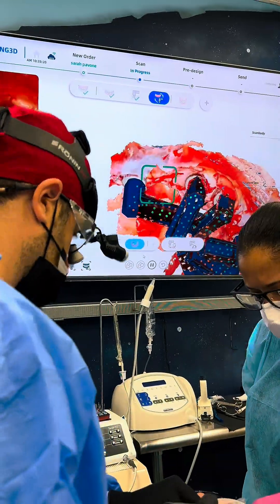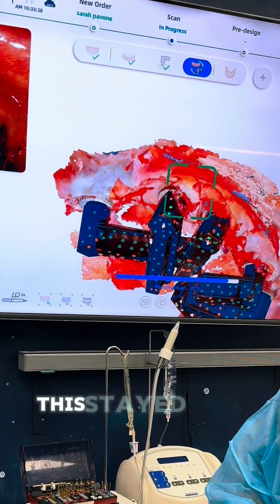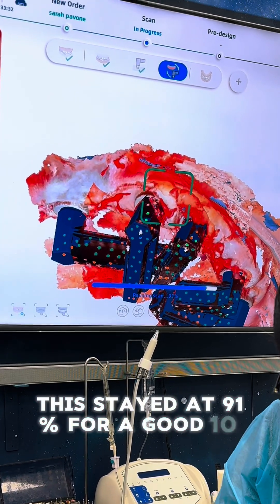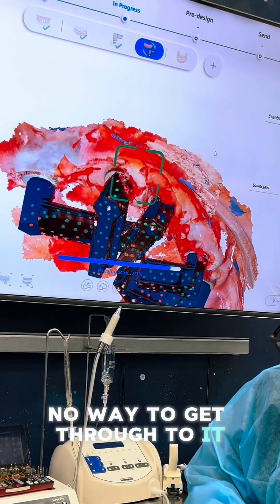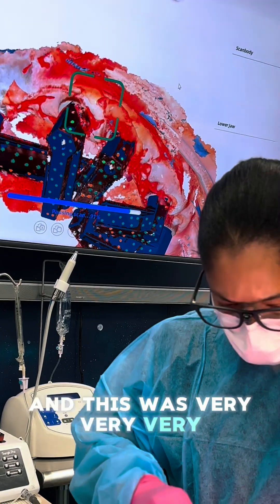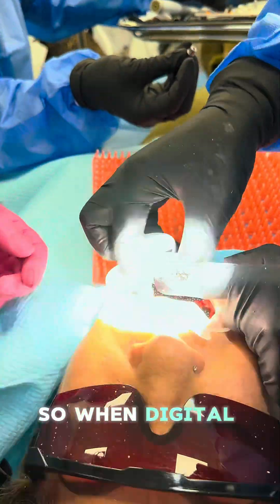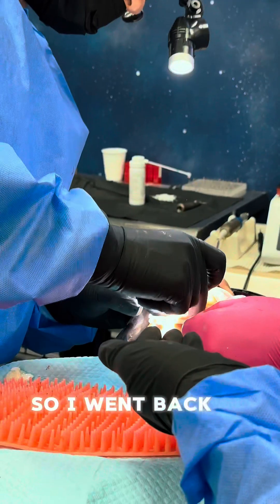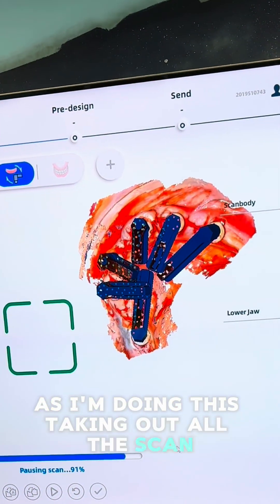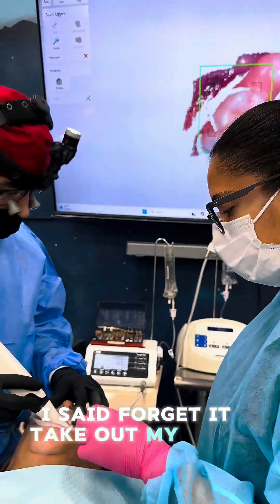Now you can see the blue bar of death. This stayed at 91% for a good 10 to 12 minutes and I could not get out of it - there is no way to bypass it. This was very, very frustrating. I have a case I need to do, so when digital dentistry fails, what do you do? You go to your next option. I went back to my trusty way - it's still stuck at 91 - so I said forget it, take out my Trios.